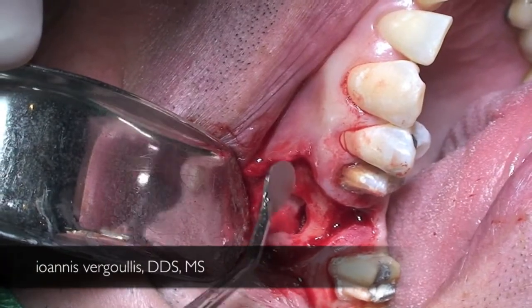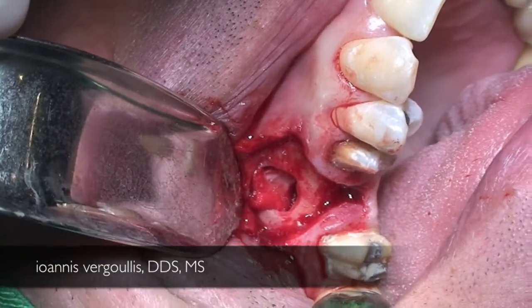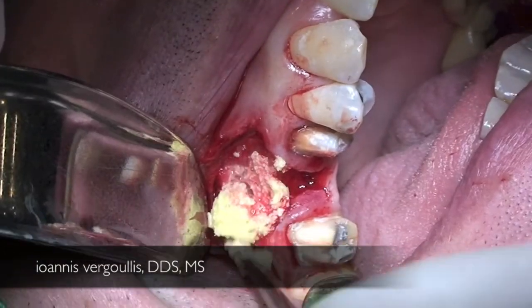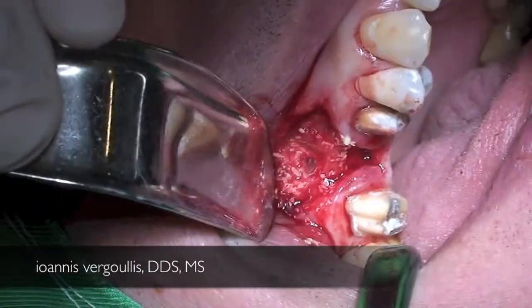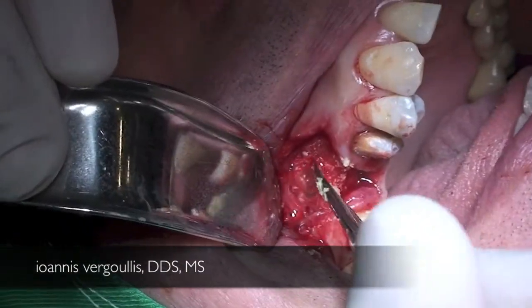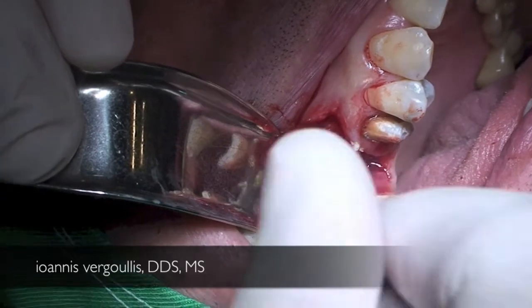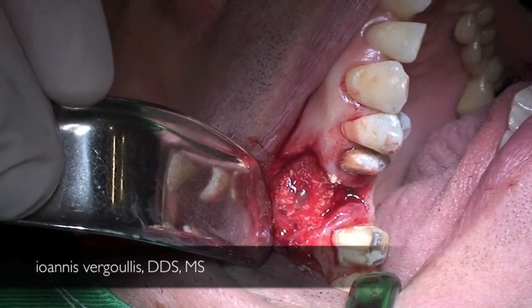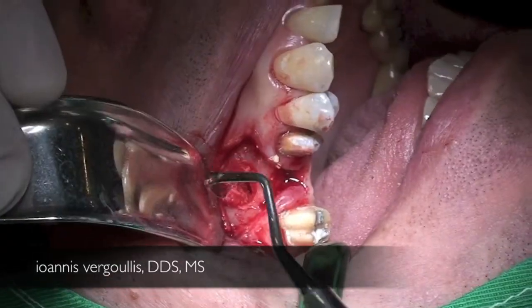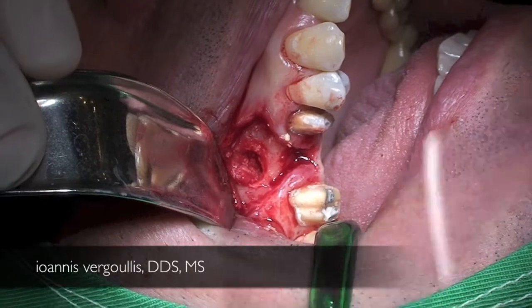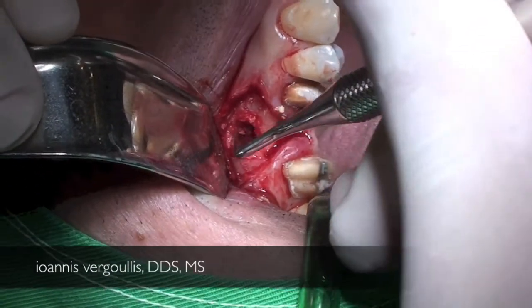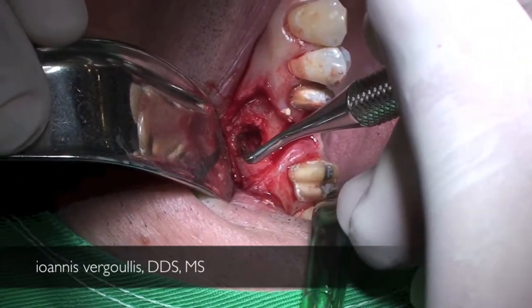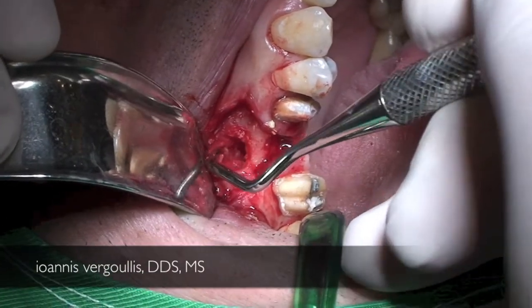After the collagen membrane is fixed in place, we proceed with bone graft placement. We utilize FDBA mixed with tetracycline and pay special attention to thoroughly condense the bone graft all the way to the medial wall, and also mesially and distally, in order to have a good amount of bone when we place our implant.